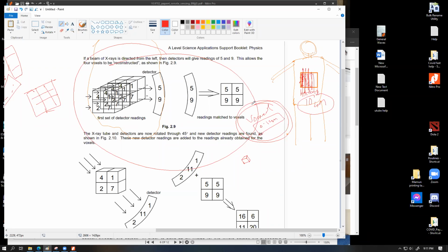Here's the deal: the physical dimension of the thickness can be varied. That's what I'm assuming, because it should be able to vary. I don't know this for a fact, but I guess the physical dimension of the pixel can be varied. But the way the process is executed is that we scan one layer or one slice, then we scan the next slice. Practically, we don't do those scans one at a time. We get the total value in a single scan, and then we add them up in the computer environment for one slice at a time.